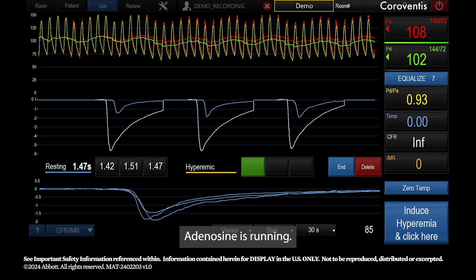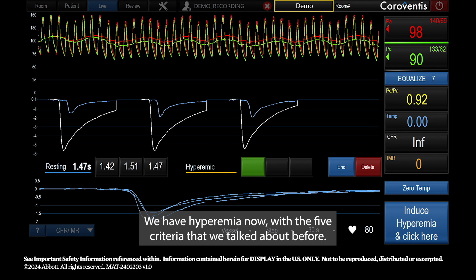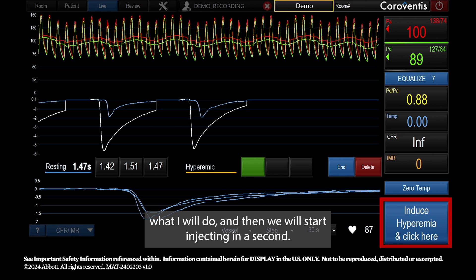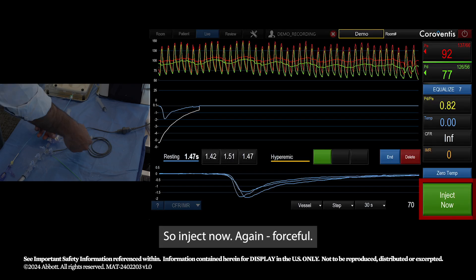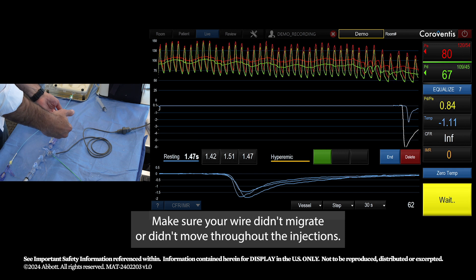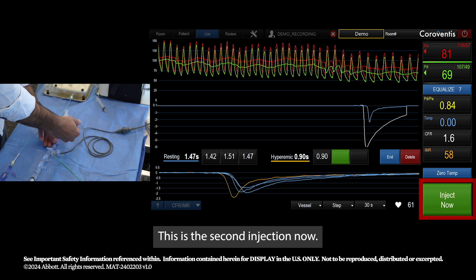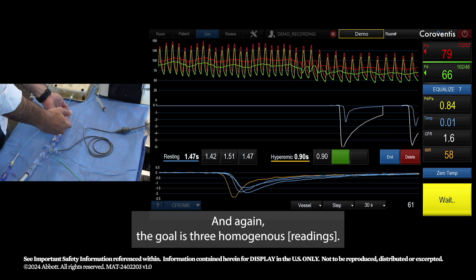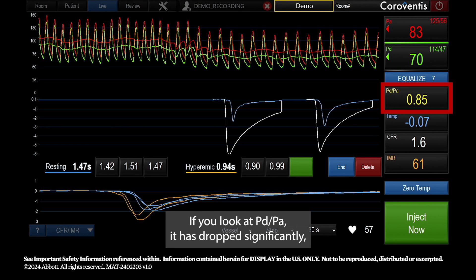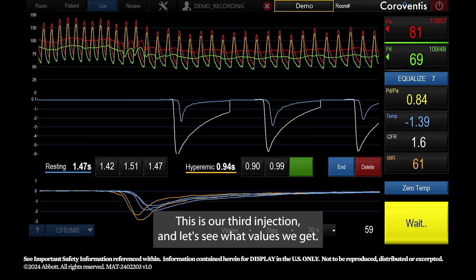Once done with the resting phase, we go to the hyperemic phase. Adenosine is running and we have hyperemia. Based on the five criteria we discussed, I'm going to induce hyperemia, click here, and start injecting — forceful injections. Make sure your wire didn't migrate throughout the injections. You can see the difference in the waveform. The goal is again three homogeneous readings. PD over PA has dropped significantly, and you can see ventricularization. Here is our third injection.